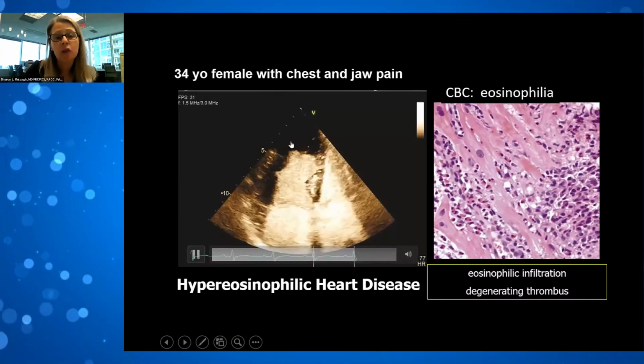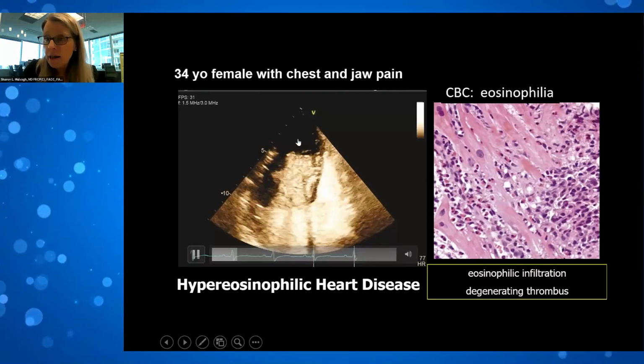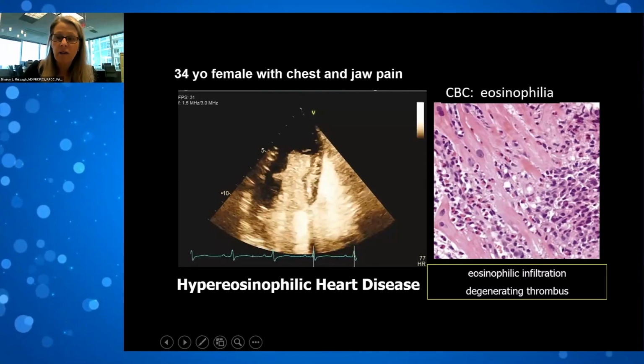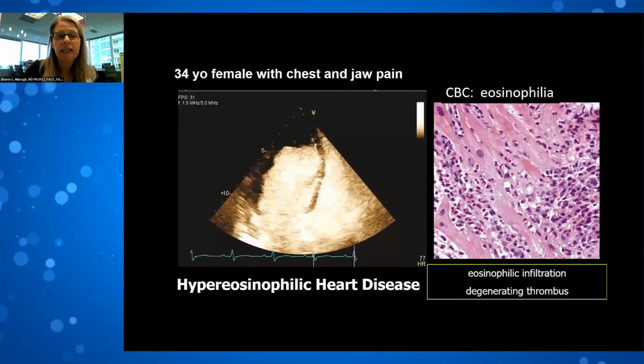There was no presence of microbubbles. So you could be certain that this was not a tumor and this was not myocardium. So this is how, not only in the definition of the wall motion and the cavity or the cardiac structures, but also the characterization of those structures.